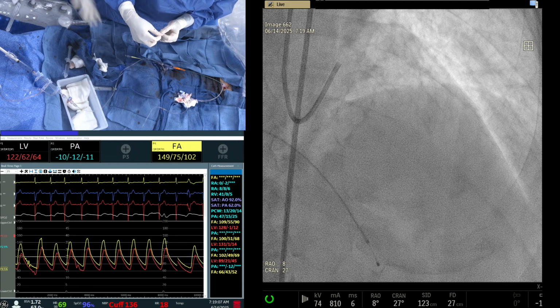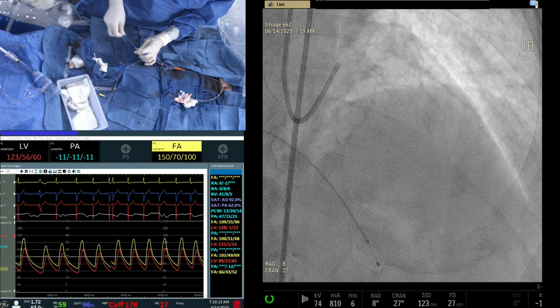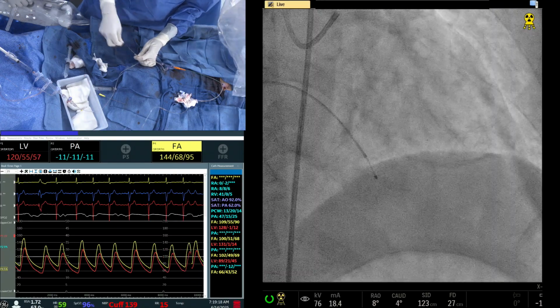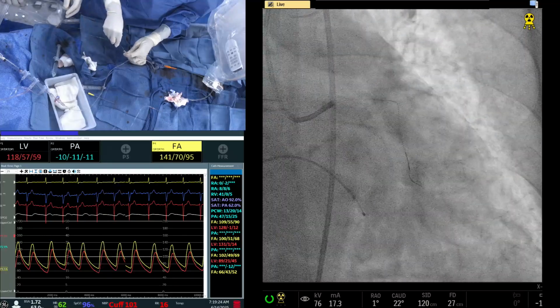Even in India also now, right? I know the legacy rotor, the old one, is still there, but here in the whole of America and I think the rest of the globe, that has all changed completely now. Everything is Rota Pro. And we are working on the second part of the rota, that the burr gets stuck many times.